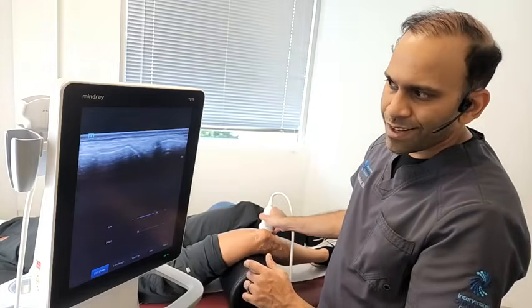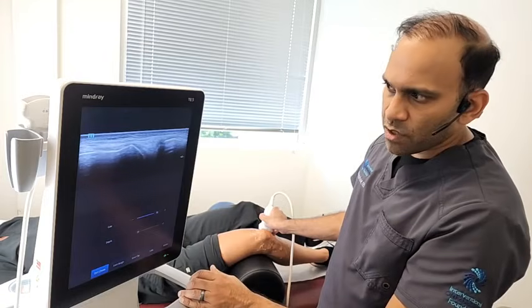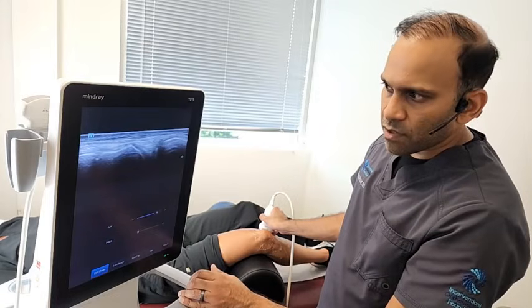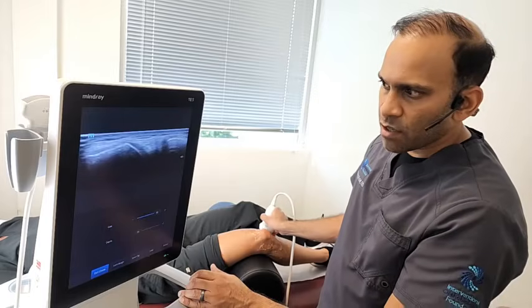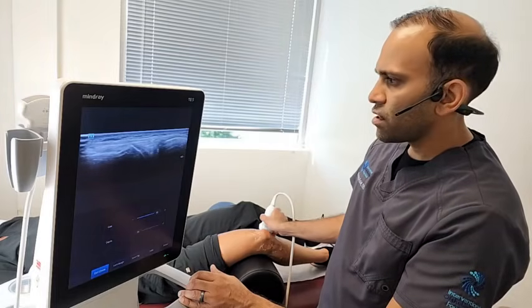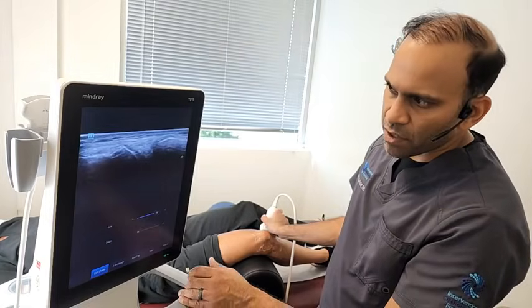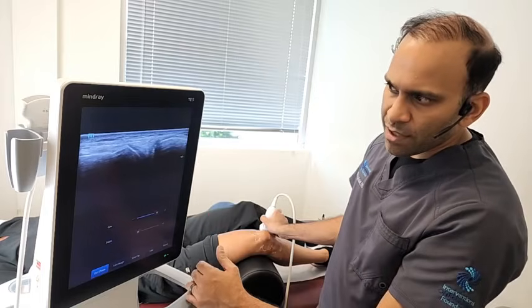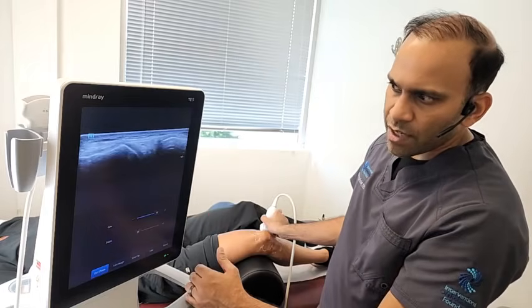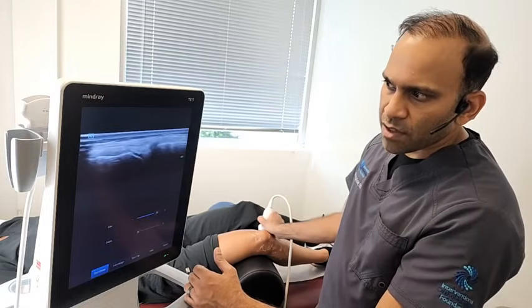Okay. And I see a little bit of some schmutz going on in there. Can't say for certain if there is a little bit of some sprain or tear in that meniscus going on. Lex, do you have pain on this side of the knee? Every now and then. So maybe there's a little bit of something going on here. See, there's a little bit of black that we see inside there. A little different than what we saw on the other side. So this may have been a little injury that occurred in the meniscus on this side.